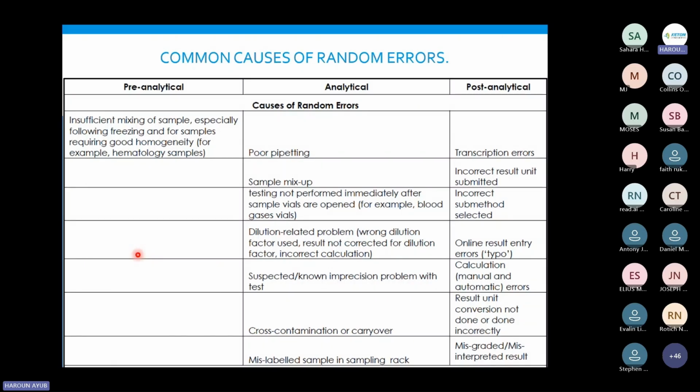Remember also when you're mixing that particular sample, they tell you to swirl. Swirling is putting it on the table and rotating it clockwise, like this. Don't lift it up and shake. The creation of bubbles usually affects reconstitution. And remember, that stopper that comes with the EQA has dust particles for that particular analyte. Remember, you have to invert it upside down for at least 5 minutes so that it can also dissolve those particular aspects that are on the stopper.